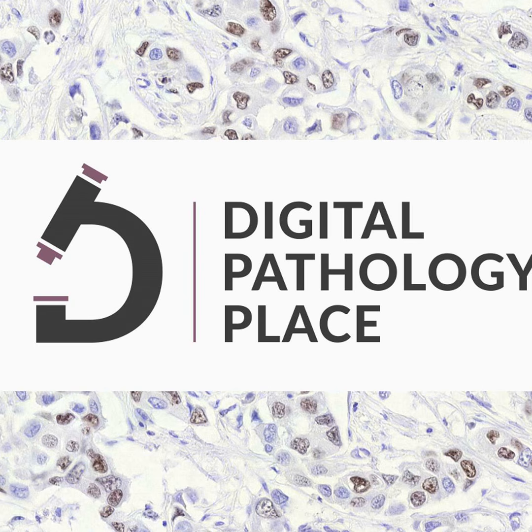And the AI applications for non-gynecologic cytology. So this was cervical cytology. This is Pap screening, Pap smears, cervical cancer screening. But non-gynecologic cytology, this has just begun. The problem is the variety of cytology specimen types and preparations with associated unique characteristics presents technical challenge for the complete digitization of the cytology workflow.